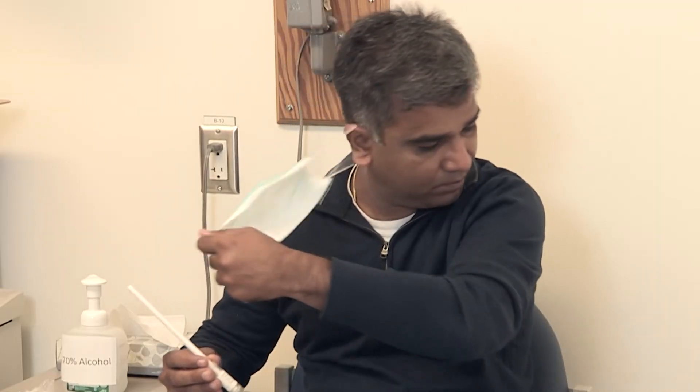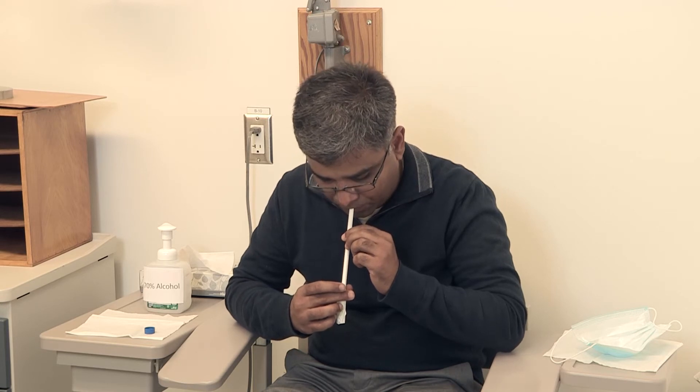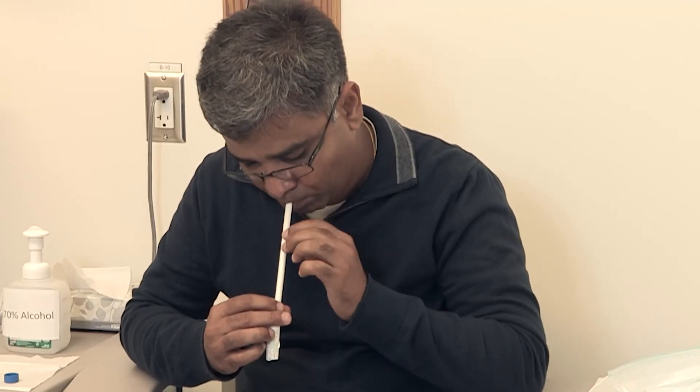Remove your mask. Begin by allowing saliva to pool inside of your mouth. You can rub the inside of your cheek with your tongue, or massage your cheek to produce more saliva.